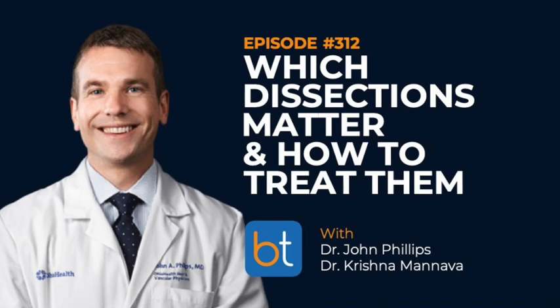And so I have my staff, they have the Doppler out. We're checking to see what the pulses are as the procedure moves forward. Hopefully we'll get a device like the FlowMet from Medtronic and maybe use that to help guide whether or not we're done treating things. But a lot of times I've put a stent in or a tack in where I think there might be something going on, and then I'll reassess flow.